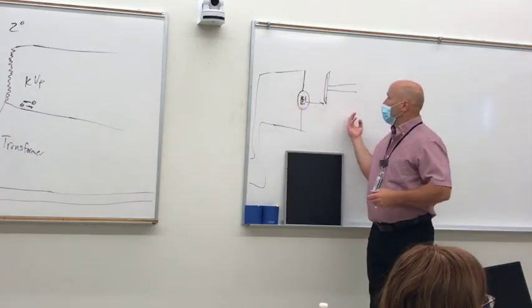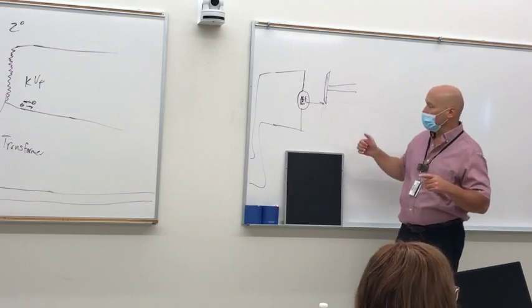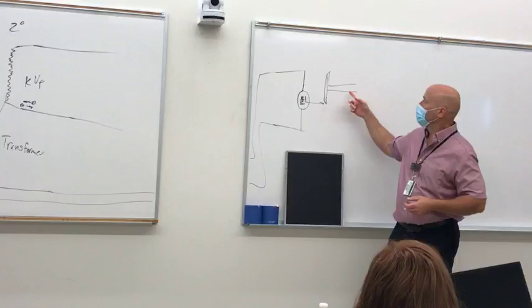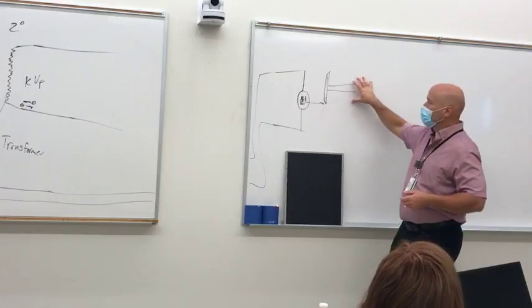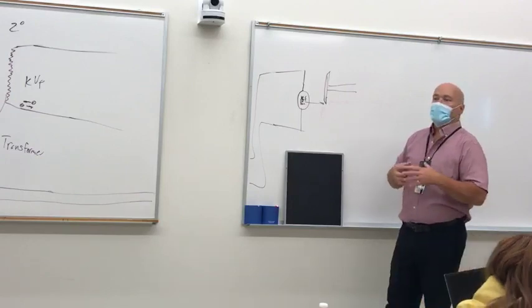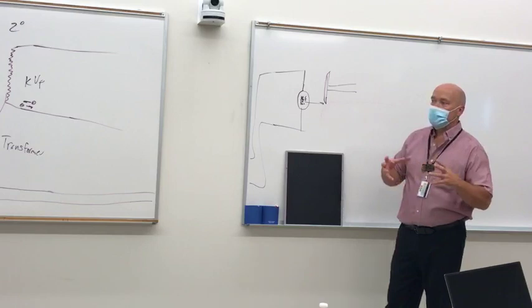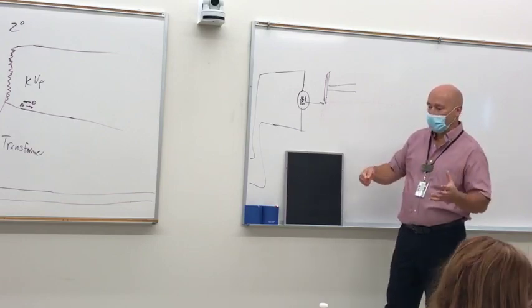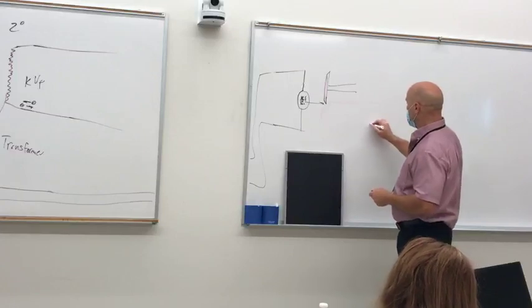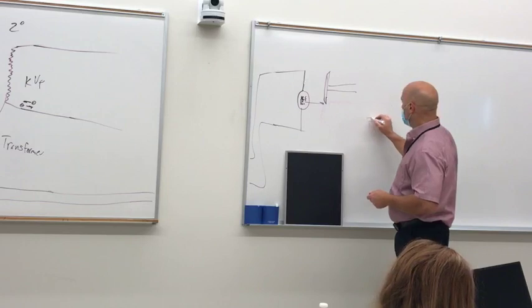All right, so we're going to send the electrons. When we push the prep button, what's going to happen is we light this up and we spin this. The purpose for spinning this is to change the point of impact, okay? So something heats up, let's say you put a pan over a fire, you've got a fire going here, and you put a pan over it like that.